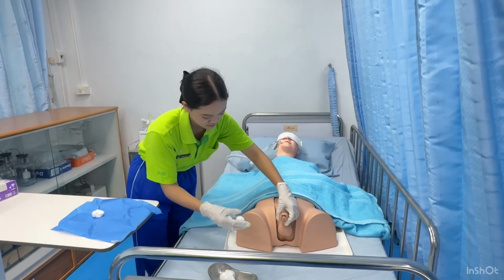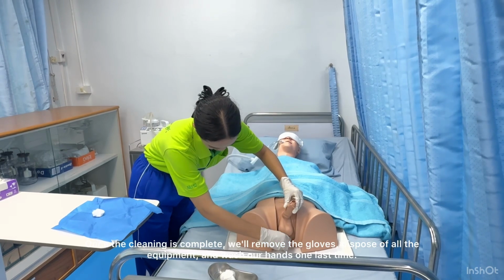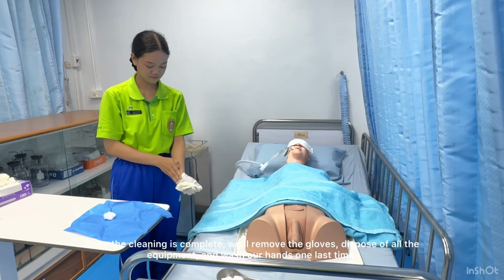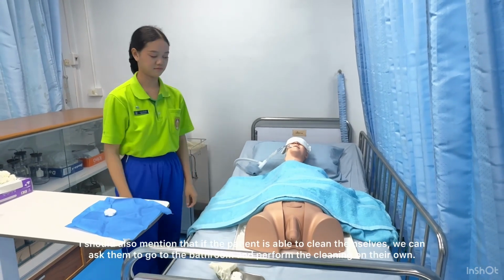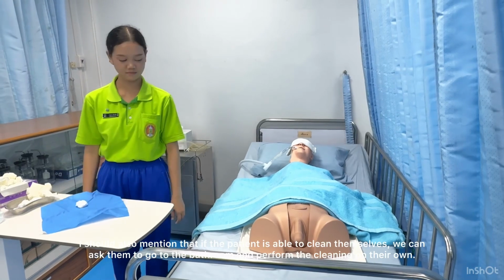Once the cleaning is complete, we'll remove the gloves, dispose of all the equipment, and wash our hands one last time. I should also mention that if the patient is able to clean themselves, we can ask them to go to the bathroom and perform the cleaning on their own.